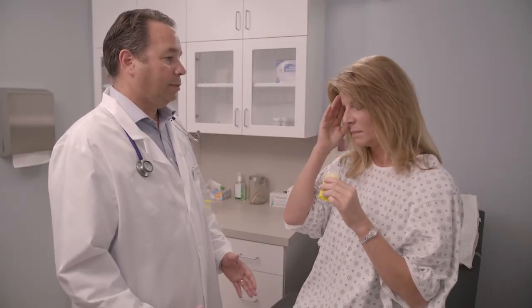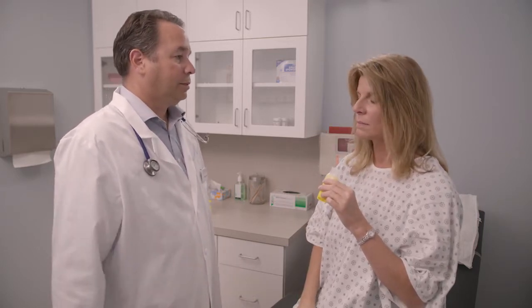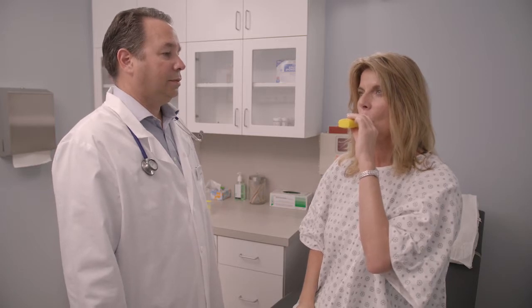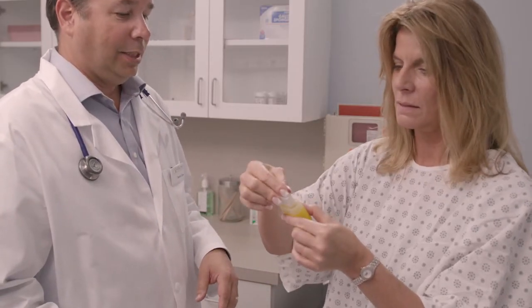If you feel dizzy or lightheaded while using the pocket PEP, take the mouthpiece out of your mouth, breathe normally, then begin using it again. If you still feel dizzy or if you have any other problems while using the pocket PEP, stop treatment and talk to your healthcare practitioner. Use the pocket PEP as often as your healthcare practitioner tells you to. Keep using it even if you are only bringing up a little mucus. Keep the OPEP mouthpiece covered with the dust cap when you are not using it.